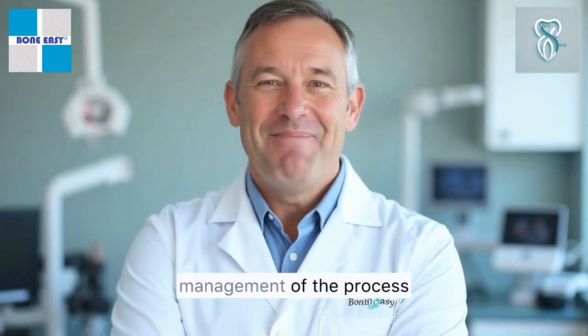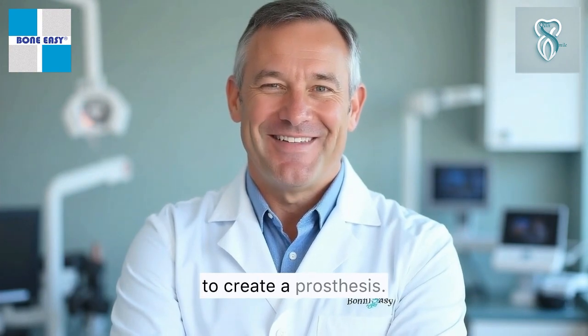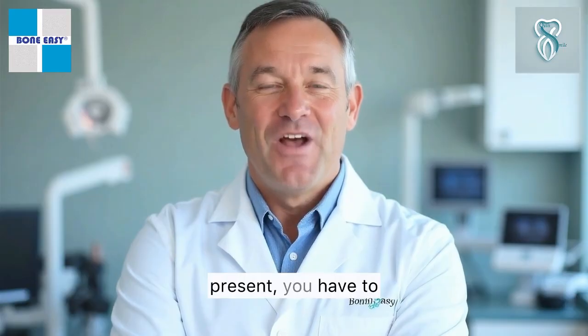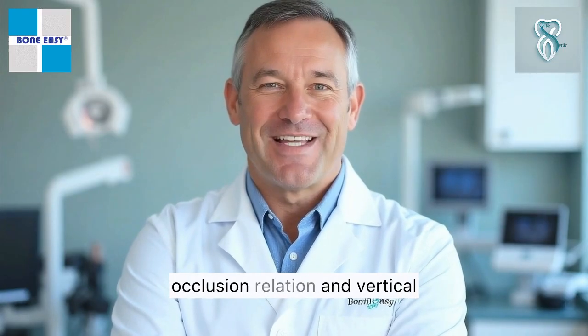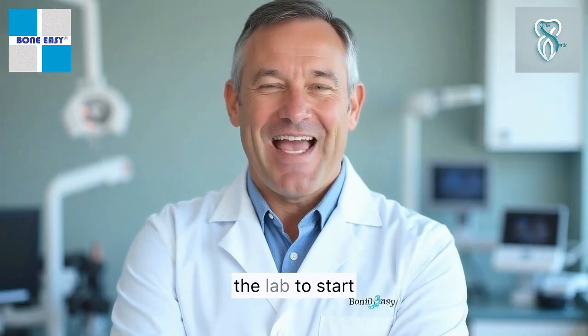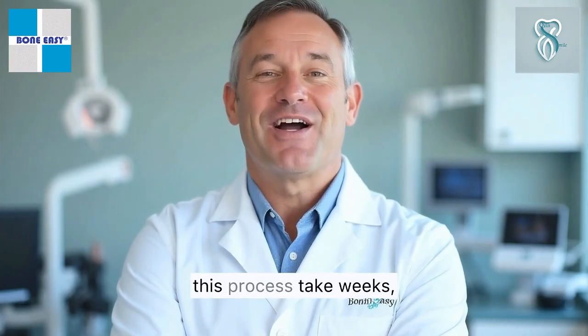Let's talk about time management of the process to create a prosthesis. As things stand at present, you have to make molds and send them to a laboratory, wax rolls to determine occlusion relation and vertical height. Send back to the lab to start making try-ins. Sometimes this process takes weeks.